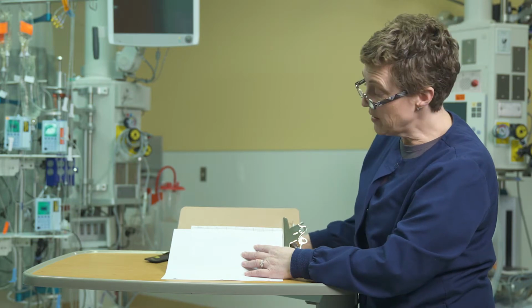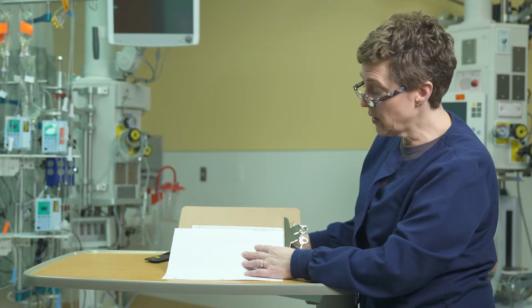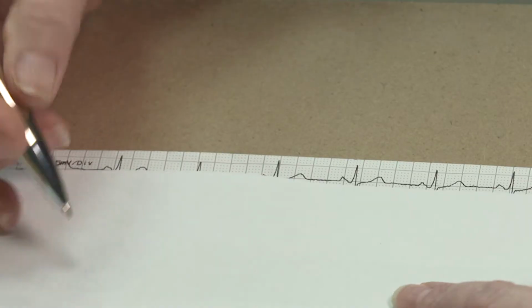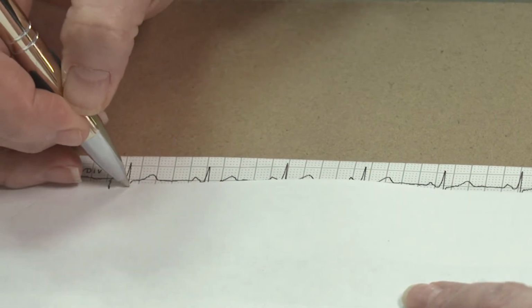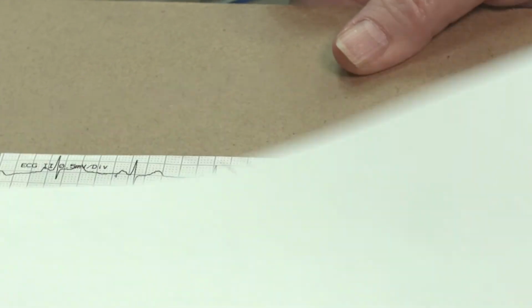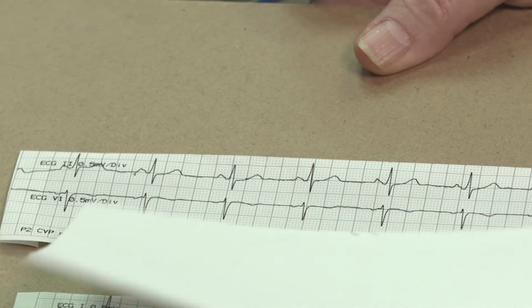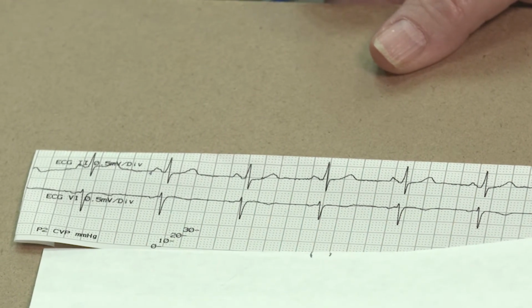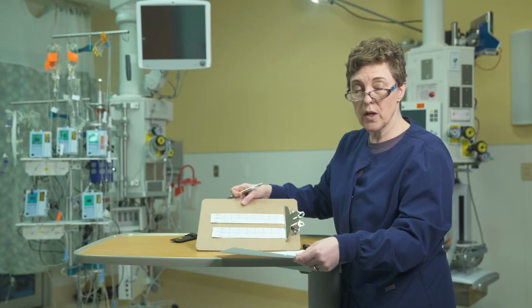Another method for measuring intervals, if you don't happen to have a set of calipers in your pocket, is very simply accomplished with a pen and a piece of paper. And you do the same thing, except now you're marking it with a pen on your piece of paper. Again, I can take that and I can determine my regularity as I just move it across. Just like I did with my calipers, and now I can take it down to a reference line and measure my intervals. So the same thing is accomplished, but very low tech, but very effective.